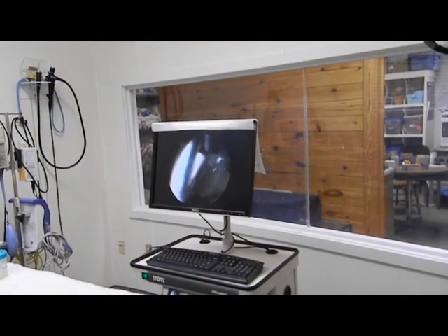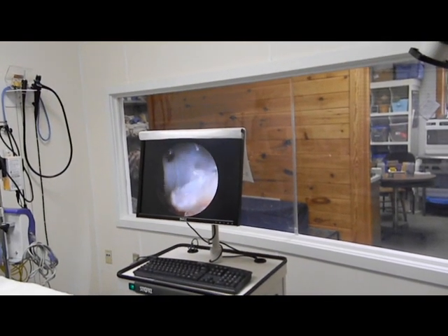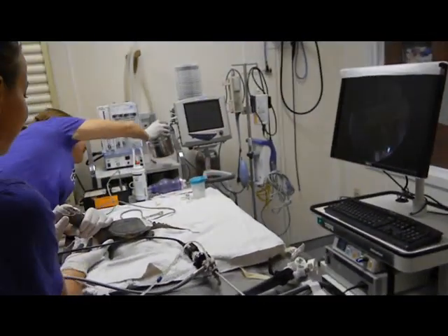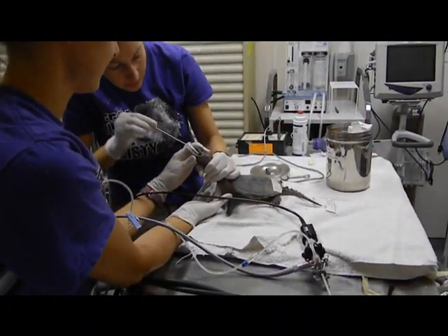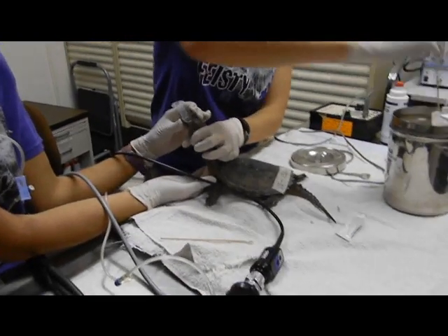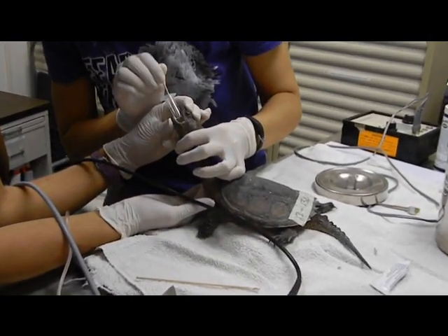Open. Grab. Okay. Yeah, it's not going to come all the way. Okay, you have become one with the turtle. Oh, there you are. We may just end up kind of pushing it down, but I'm okay with that. As long as it's far enough down that it's not going to kind of come back up.